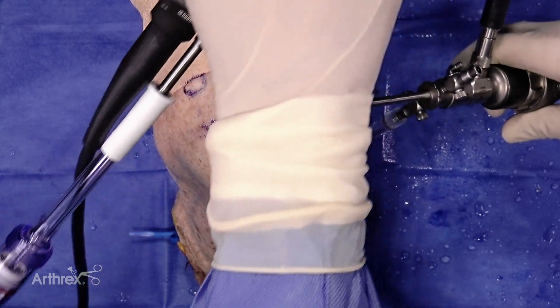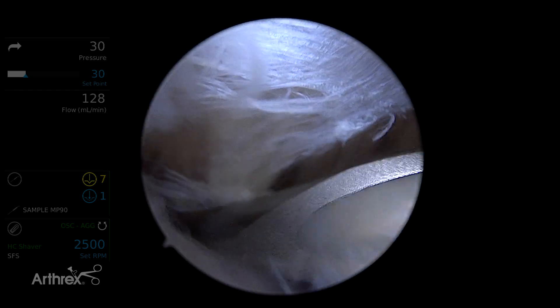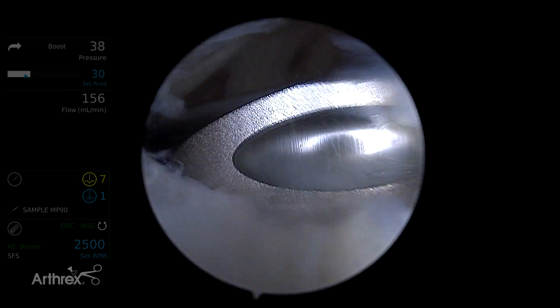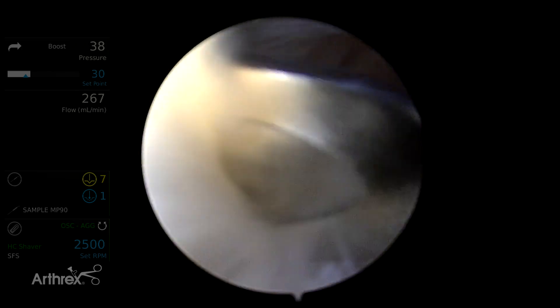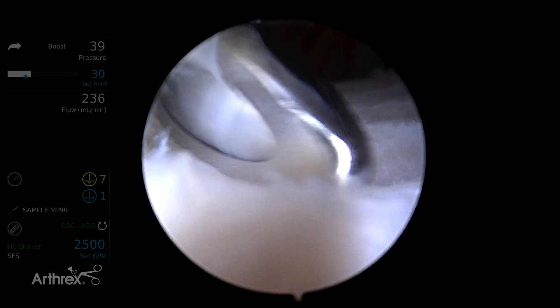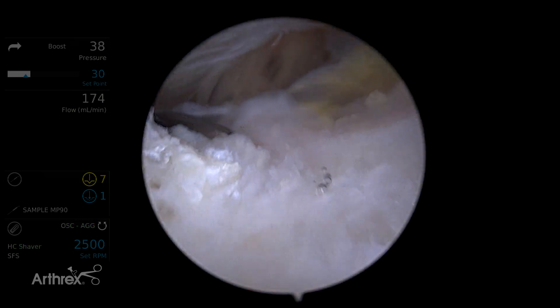Now that I've got my GraphNet set up, I'm going to insert it into the shoulder. We've got our GraphNet hooked up, so now I'm going to find my shaver and perform our bursectomy. I tend to oscillate my suction, making sure I don't take too much bursa. I want to try to preserve deltoid fascia as much as possible. I'm going to work my way back doing a normal subacromial bursectomy. You can see that the GraphNet is collecting all this bursa tissue.